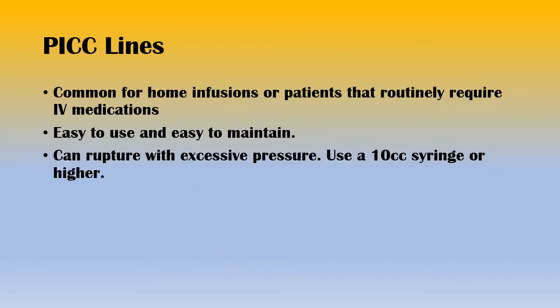PICC lines are common for home infusions or patients that routinely require IV medications over a short period of time. Obviously, it's not something that's going to be left in over many years, but it can be left in for a couple months. They're easy to use and maintain. Oftentimes, they're maintained by family members. The big drawback is they can rupture under pressure.